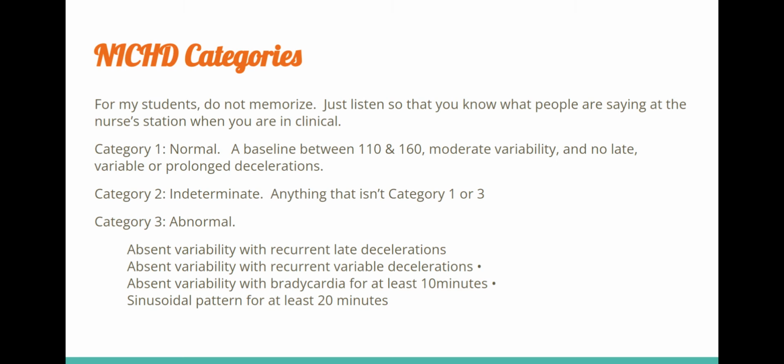Okay. So a lot of references will talk about NICHD categories. I really don't test on this in my class. So if you are viewing this as a student of mine, you do not need to memorize it. I just want you to listen so that you know what people are saying when you're at clinical or if you read it somewhere. When you go to labor and delivery, you will have to be familiar. If you work in that area, you will need to know these. But you'll get more familiar with that.